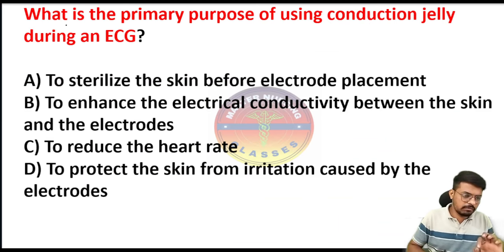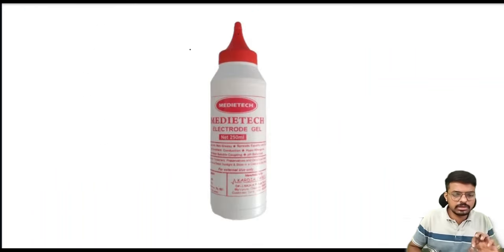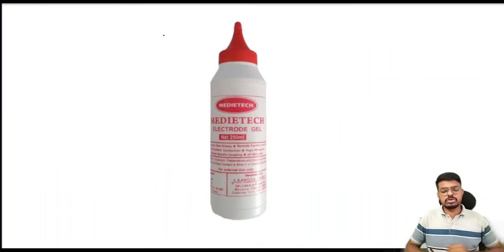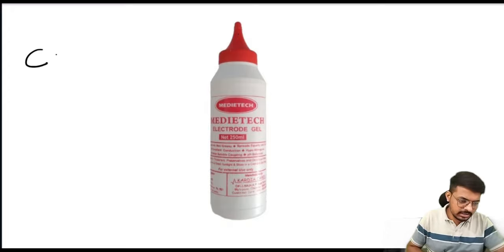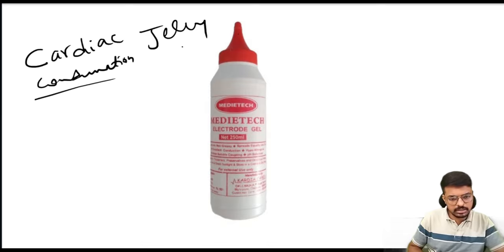So here is the next question for you. What is the primary purpose of using the conduction jelly during the ECG? I think all of you have seen this bottle with the ECG machine. We call this the cardiac jelly, or we can also say the conduction jelly.